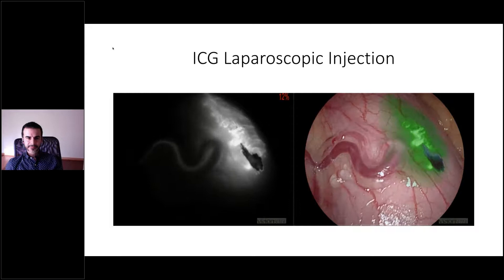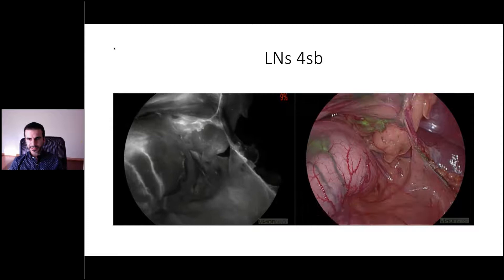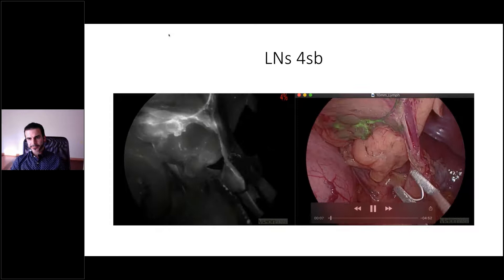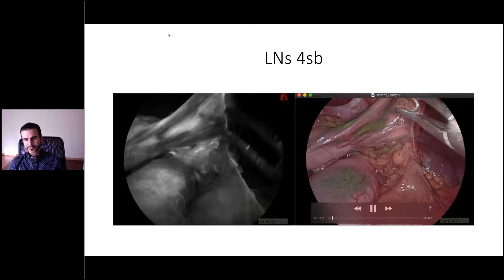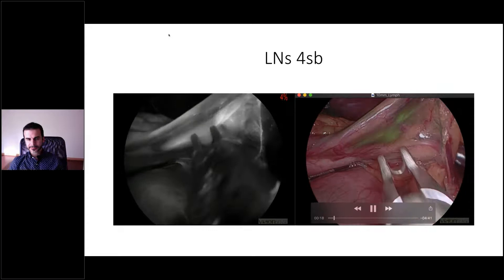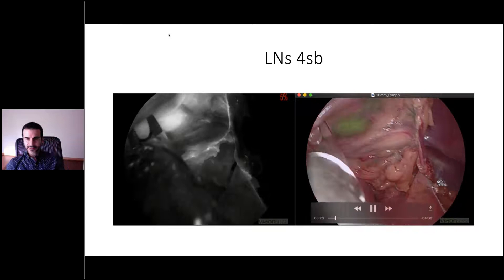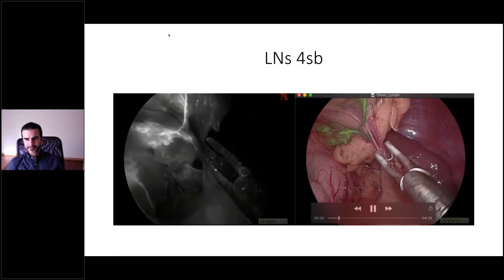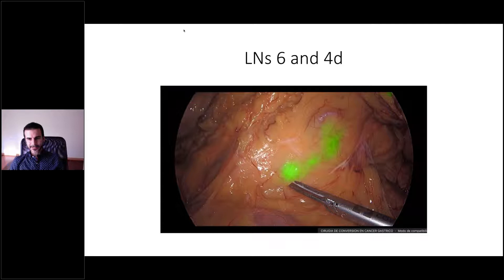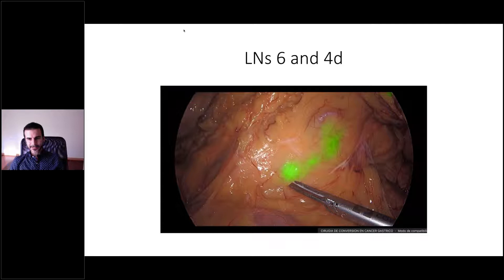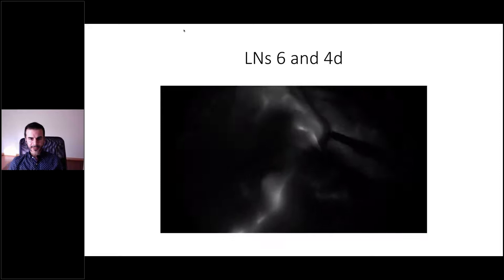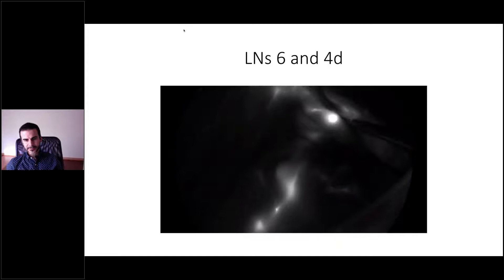The dissection then starts. You can see the left gastroepiploic vessels and group number 4sb lymph nodes — the exact position of the lymph nodes is visible and they are staying with the specimen. You can see the lymph nodes that guide your dissection. We are now dissecting the lymph nodes of the distal greater curvature, and you can see very clearly the infrapyloric lymph nodes — the most difficult part of this surgery.